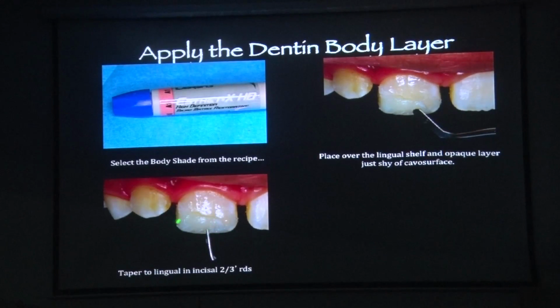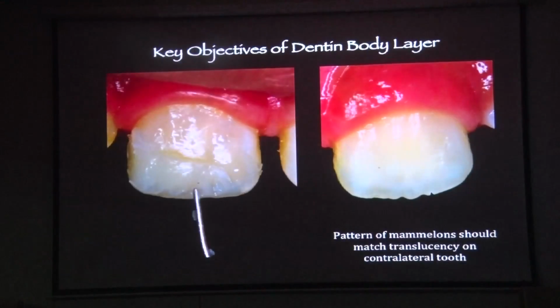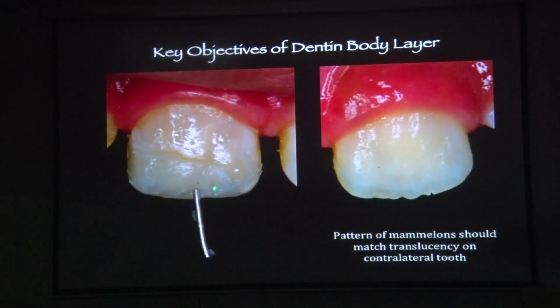Now when you are placing dentine in a class 4, make sure you taper it more lingually. Means the dentine thickness should be more here, as you come down, taper it. I see many of them just put one layer and they keep the thickness exact from top to bottom. That is when all the problems start. Always keep the dentine shade irregular, never make it flat, keep it irregular. And now judge how much space you have to place your enamel.